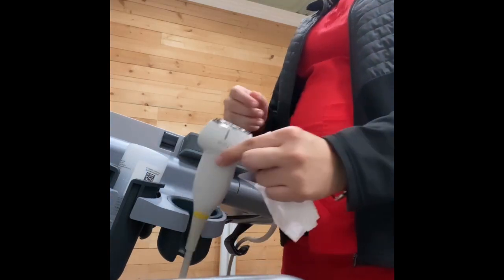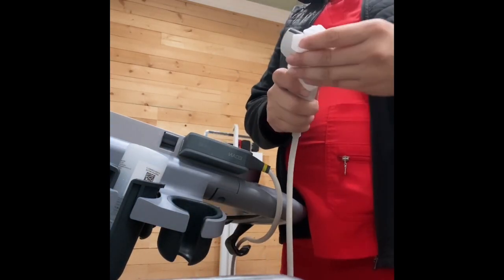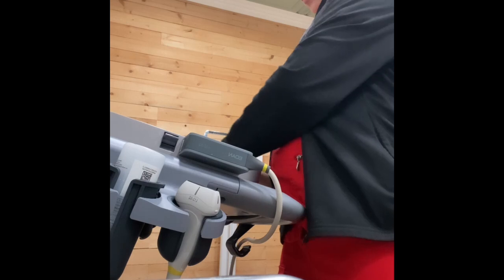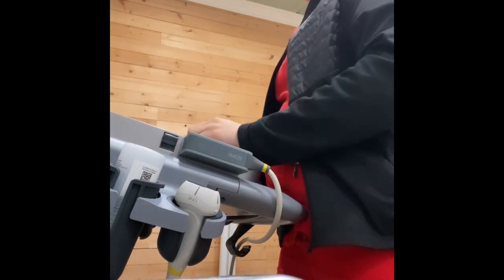This concludes the right side lobe thyroid protocol that was just demonstrated. Once ending the protocol or exam, make sure your area is nice and clean, and clean up after yourself to prepare for your next exams.